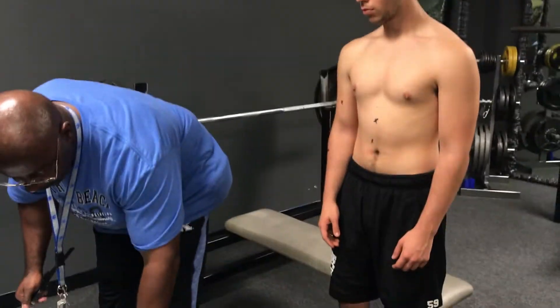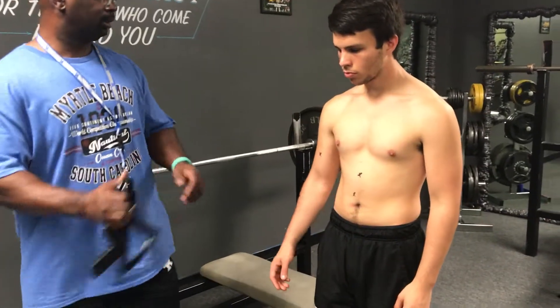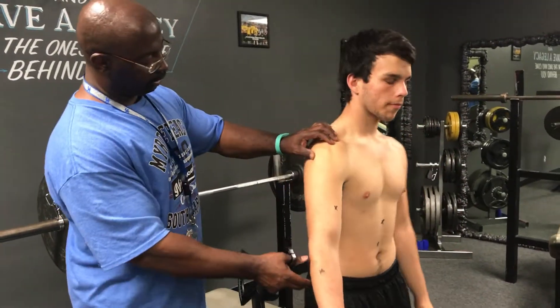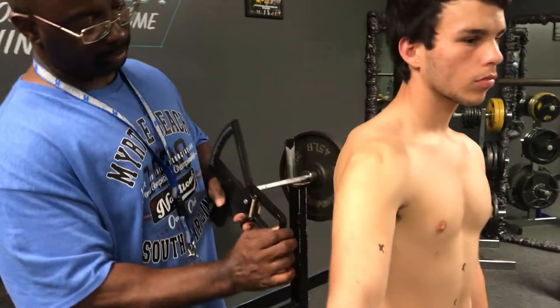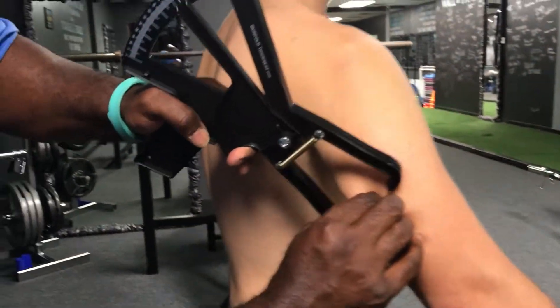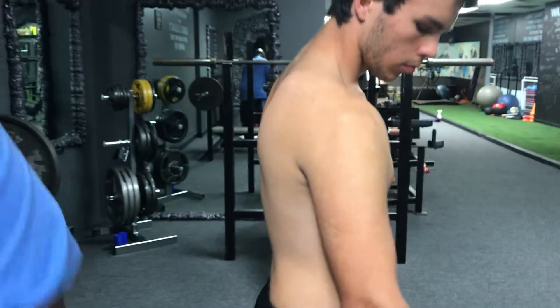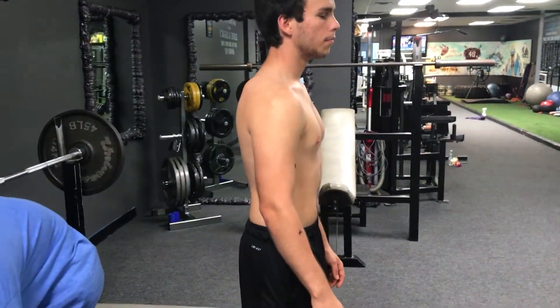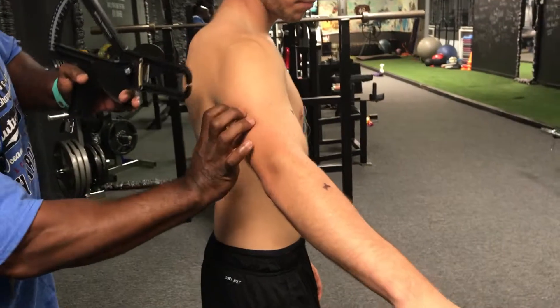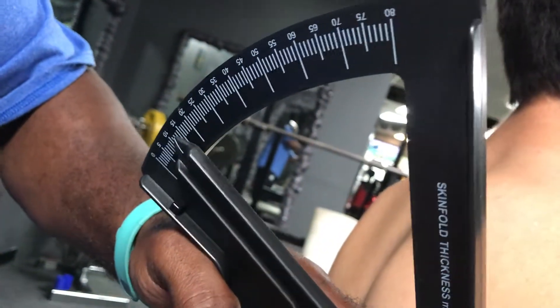Next I'm going to do your triceps, measured between your shoulder and elbow. Go ahead and turn around. Right at 12. I'm going to write that down. Let's do it again — tricep — and it's right at 12. Excellent.